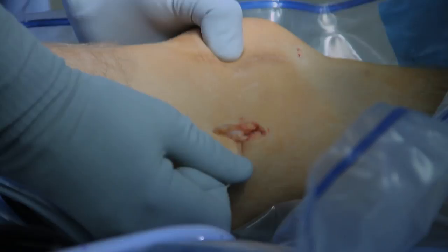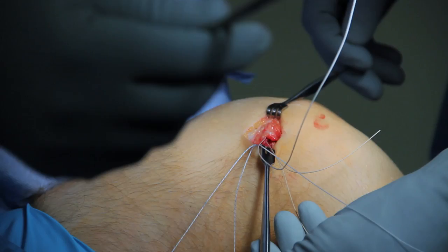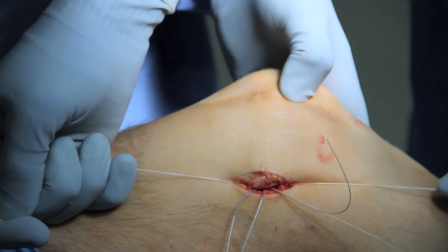The repair is performed by putting a suture anchor into the bone and then re-docking the ligament to the location of its original anatomic origin. By repairing the medial patella femoral ligament back to its original anatomic location, the kneecap can no longer be dislocated and is now stable.